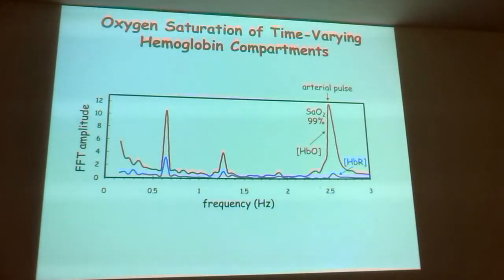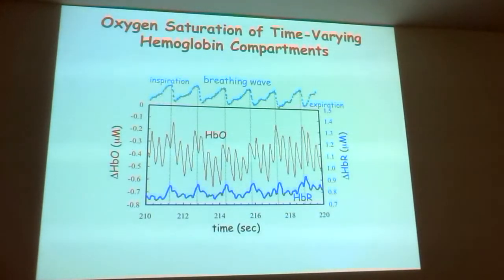Respiration modulates heart rate. The envelope of the heart rate is modulating blood pressure, right? So at that slower respiratory frequency, that's what's sort of tweaking. And so then the stability of the trace.